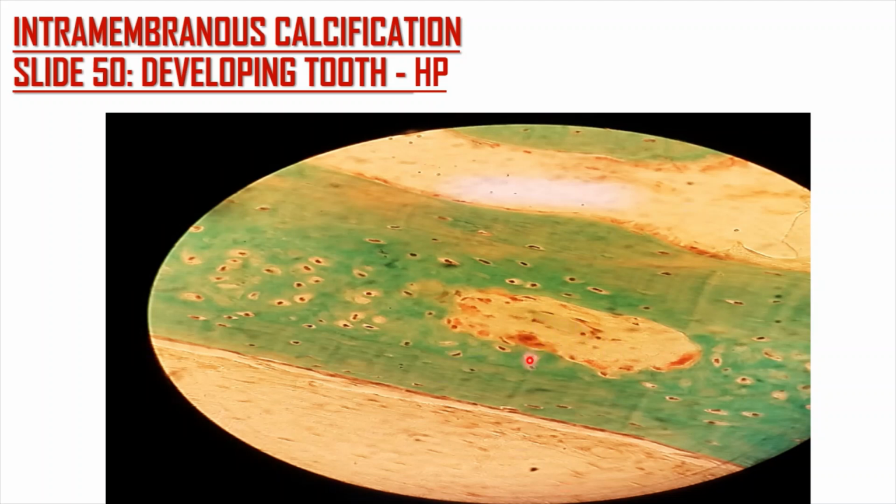Okay, so what you see, this here, this here, this here, these are just lacunae, and the lacunae have cells that are called osteocytes. So when you are drawing this high power, label this as mesenchymal tissue, and then these are lacunae containing osteocytes. This is osteoid being calcified. These cells here that you see, these are osteoclasts. And then these small cells in the middle are osteoblasts.